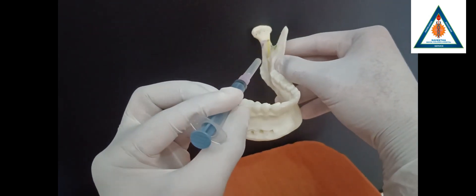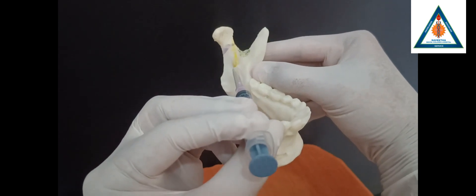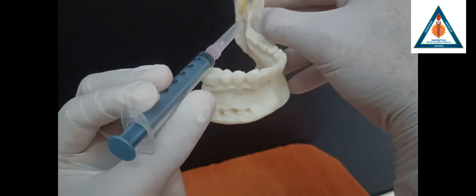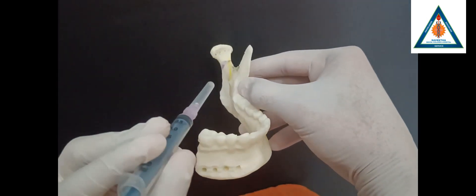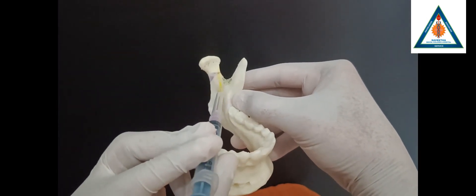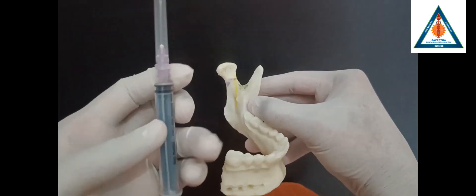Next comes the anterior-posterior position of the syringe. Usually, this will lie over the premolars or on the molar — that determines the anterior-posterior position. The last parameter is the depth of the syringe insertion.